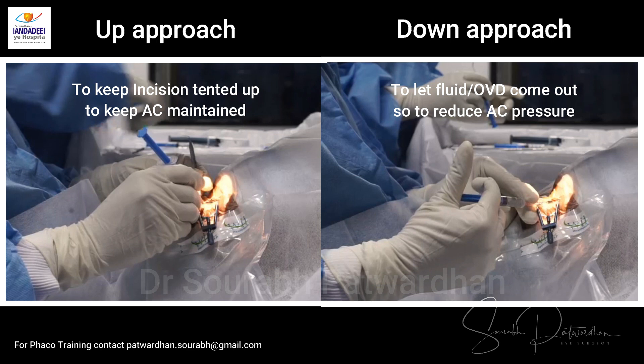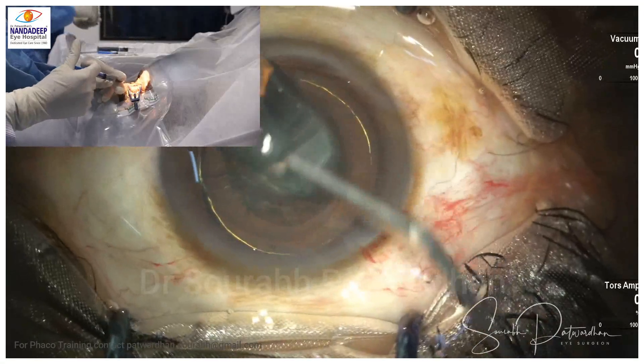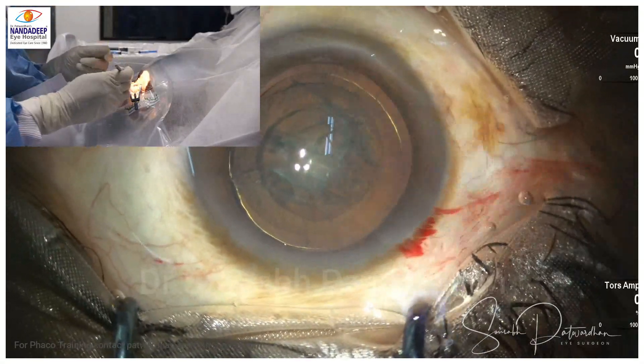Just watch this hand position very carefully. I call it the up approach and the down approach. Always think: do I want to maintain and inflate the anterior chamber, or do I want to deflate it? Then use the appropriate approach for that particular step.